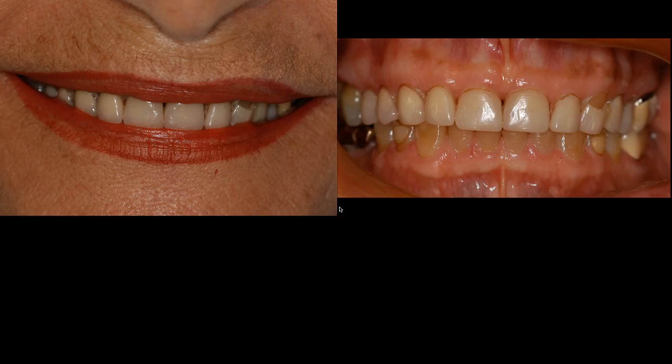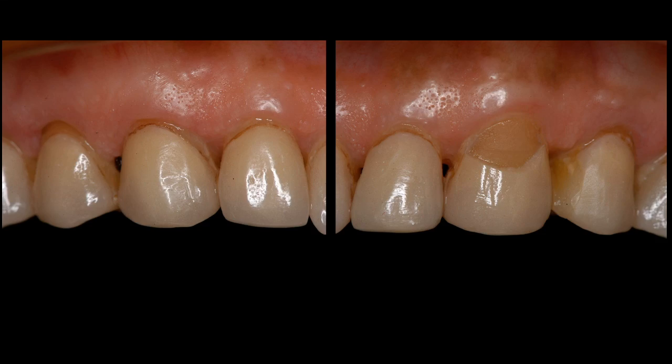As you can see, different situations, different fractures, and definitely all of them on the cervical area of the veneers. The other issue with veneers is that the weakest part of the whole system is the composite that is bonding the veneer to the tooth. It is, as we said, a sponge: discoloration, collection of bacteria, and all this excess of cement will show with time, and the gingiva will avoid this kind of material by having some recessions, and it will go away from the margin that is in composite.